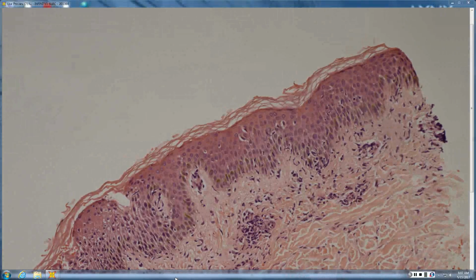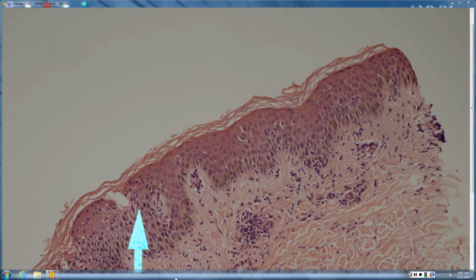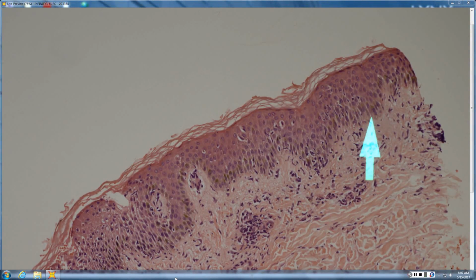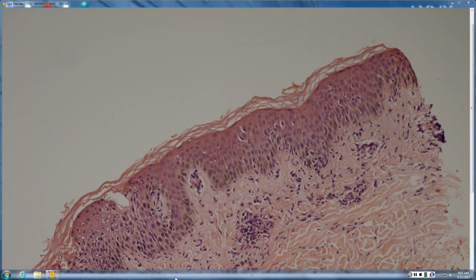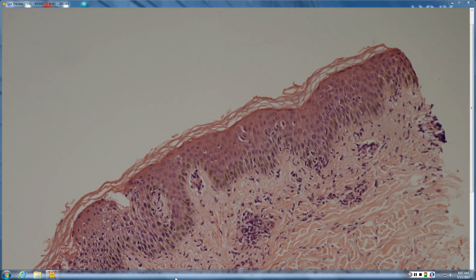So pretty superficial infiltrate. Looks mostly lymphocytic. Okay. And what pattern do you have in here? It's spongiotic. But what pattern do you have over here? More vacuolar interface. So it can't decide whether it wants to be spongiotic or interface. When you see that weird mix, what kind of things do you think of? Drug would be right at the top, viral and syphilis. Well done. You get the easy button for that. So when you see odd mixes of spongiotic and interface, think of drug, viral, syphilis.